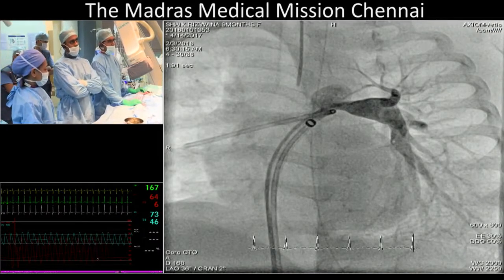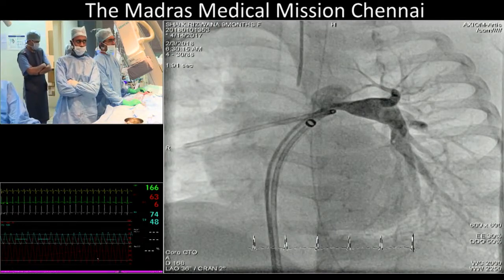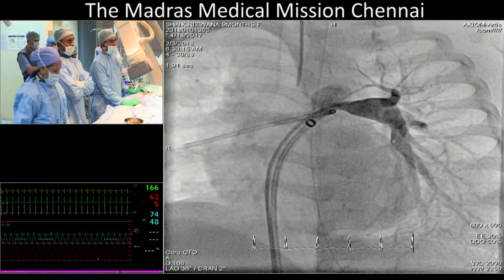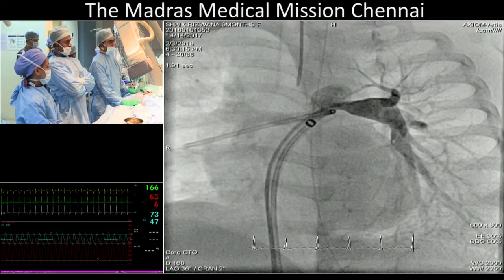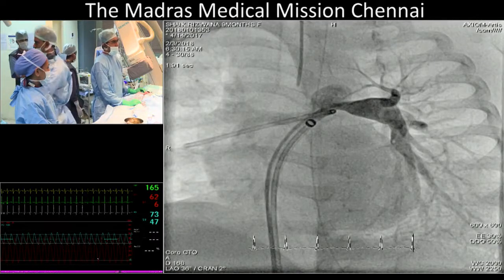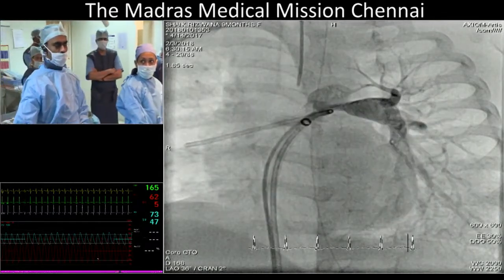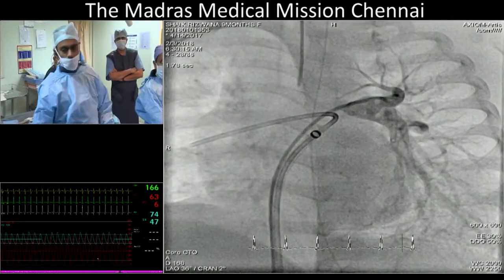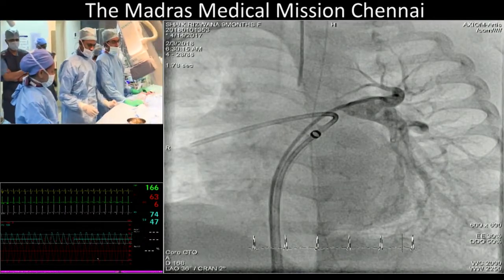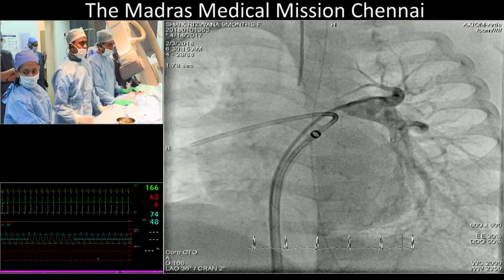I would start with the left side because you have a post-stenotic dilatation. They have a better impact from ballooning, and I would use a high pressure balloon at first, and we'll see what happens. The right side is a problem. You can dilate it, but I think the most important thing is that he does not lose the right pulmonary artery over time. But I think the Williams will be persistent, even in 1 year.